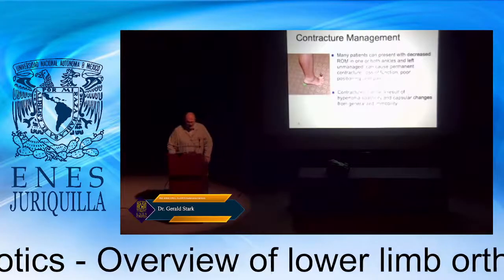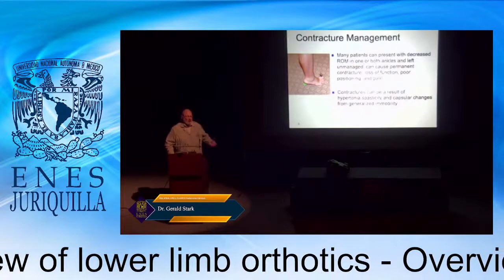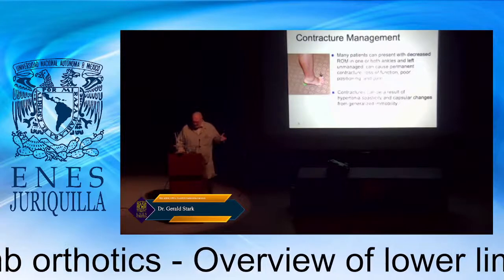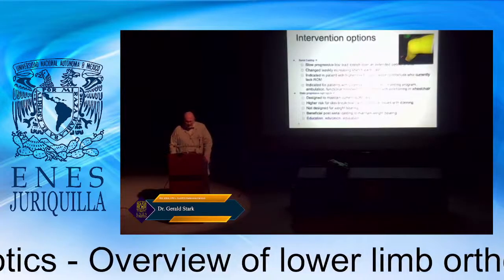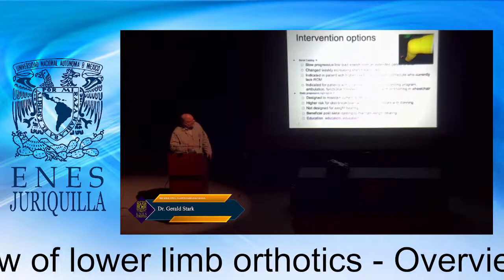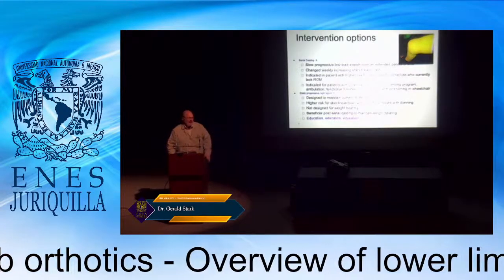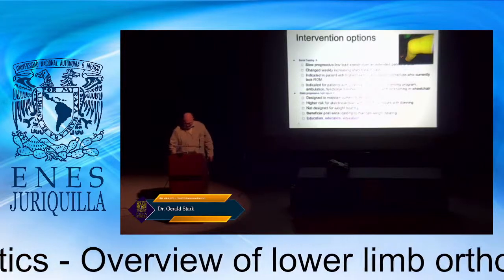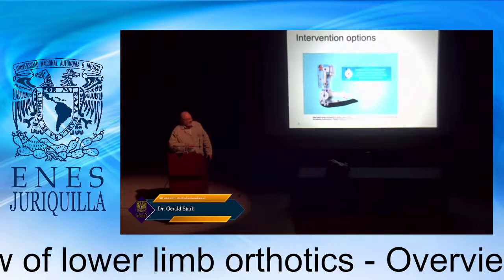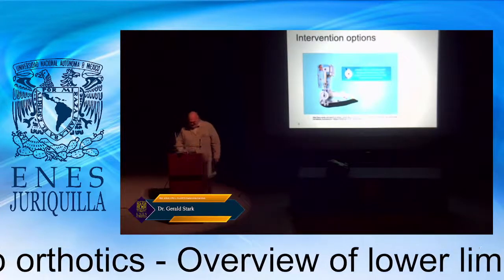Now, another thing is contracture management. Contracture management is a sub-specialty of orthotics where we're really trying to stretch the patient to allow that mobility. So it's not just about force, it's about positioning. When we look at intervention options, we can apply a low stretch over time or at night, or we can use casts to help position the child or the adult's foot and ankle and knee in the right position. And this is what we would use for contracture management, something that would dial things into a particular position. And I want you to notice in this picture, what's that? That's the rollover shape again.